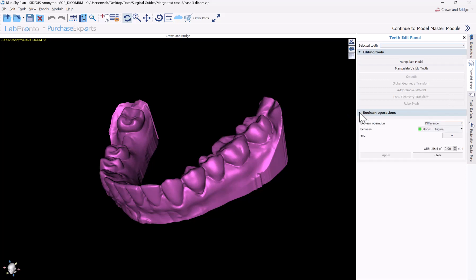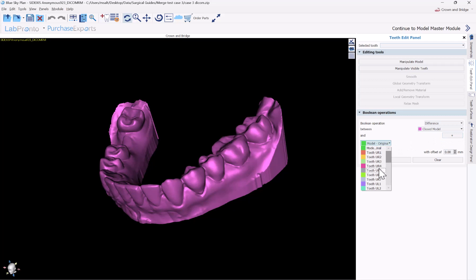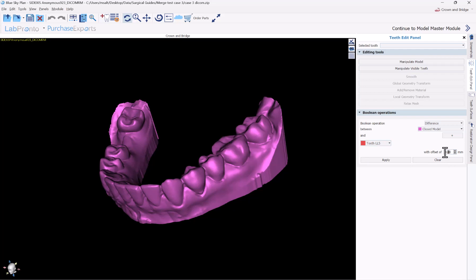You might have the boolean operations collapsed — just click on it to open it up. We're going to do a subtraction: a difference between our closed model that we just created and one of our teeth. Click the plus to add the tooth. We could increase the offset a little bit — if there's any variance between the tooth segmented from the CT scan and the actual model, it will remove material with a slight offset. I'll set it to 0.3 and click apply.